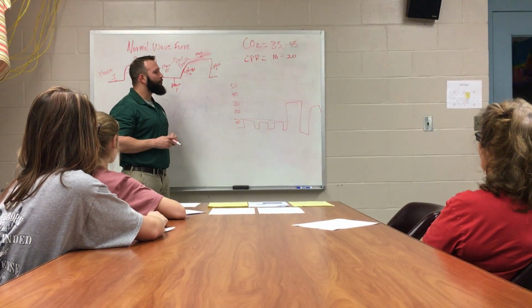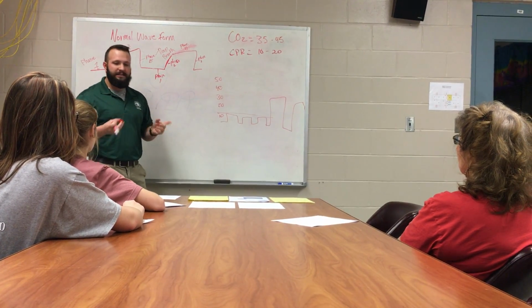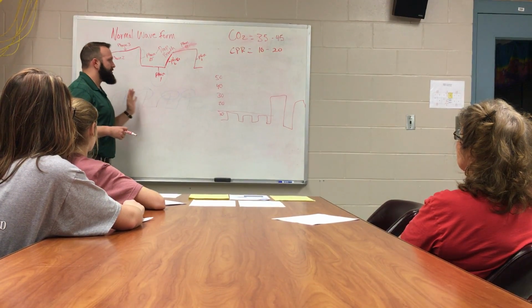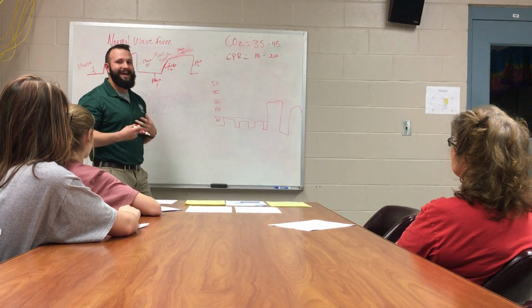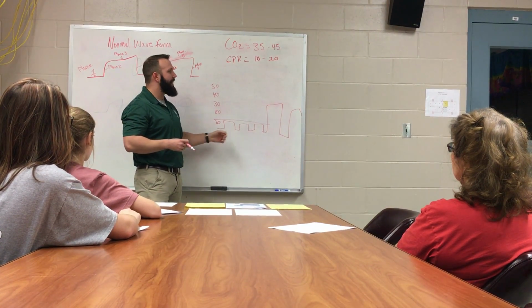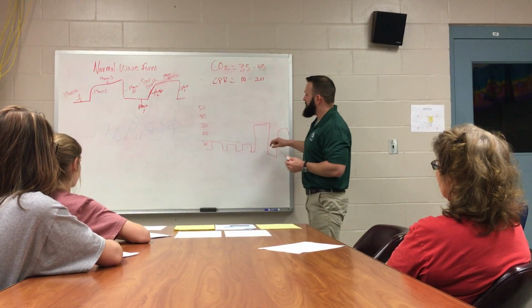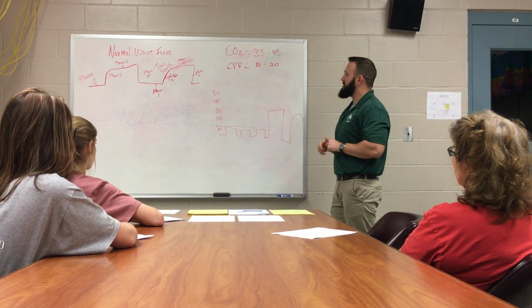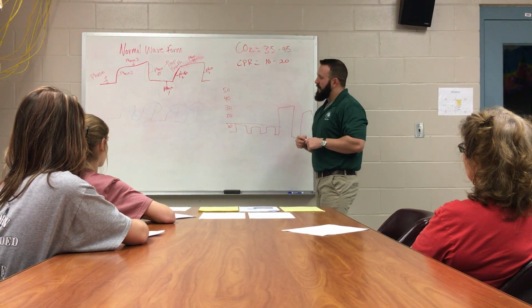So this is another great tool of how this can benefit the nurse in the ICU, CCU, PACU setting, because we're sitting here looking at our patient. We're getting a live feed of oxygen and gas exchange in your body. This is giving us a live feed, which is going to be the best thing for our patient. When we do see this, we then know that we have a heartbeat back. We know that we can start down a long list of things that we can do for our patient.